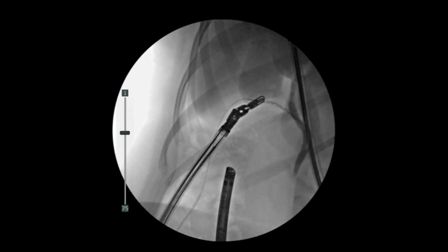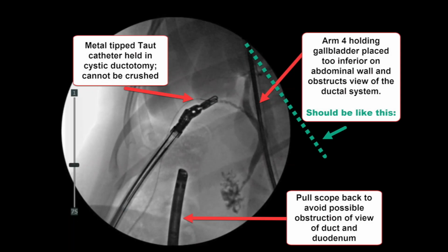The optimal initial C-arm scout film location of the catheter's metallic tip is in the center of the C-arm scout image. The assistant injects the saline and dye. The cholangiography is performed without changing the table position. In this first case, during dye injection, the instruments were left a little too close to the radiography zone. The instruments might have obscured the image.